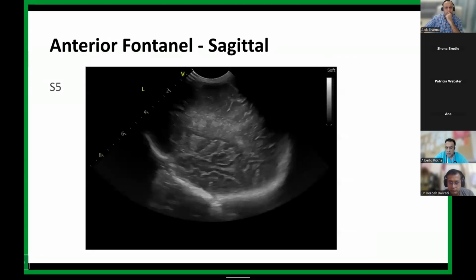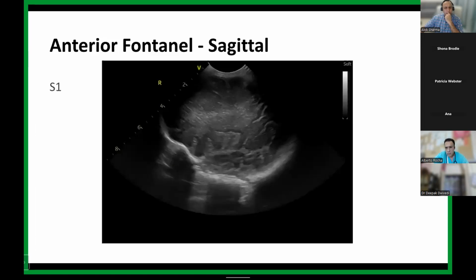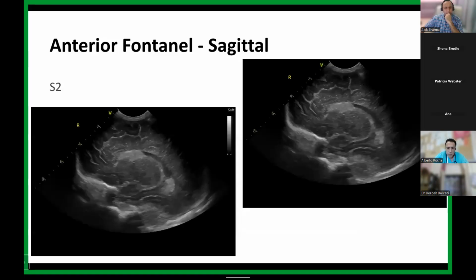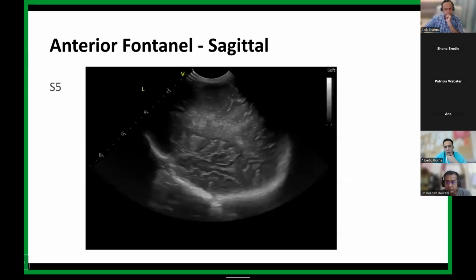Going more sagittal with the Sylvian fissure, I think this is a little bit asymmetric comparing right to left. I think the left is a little bit more echogenic. Can we go back to your right image, if it's possible? This is right. And here is left. Yes, it does look a little bit more echogenic. You're right. In the ultrasound machine, the difference was bigger.